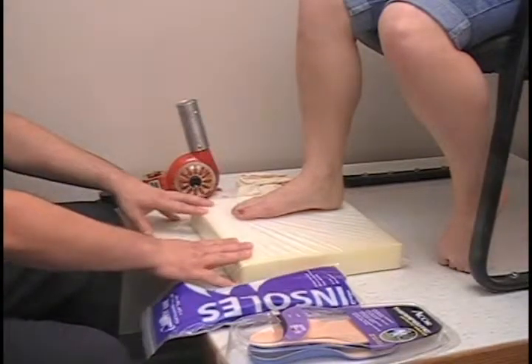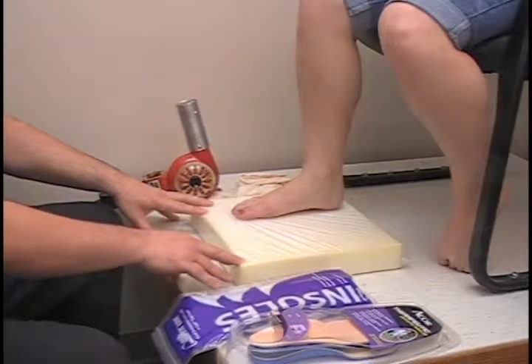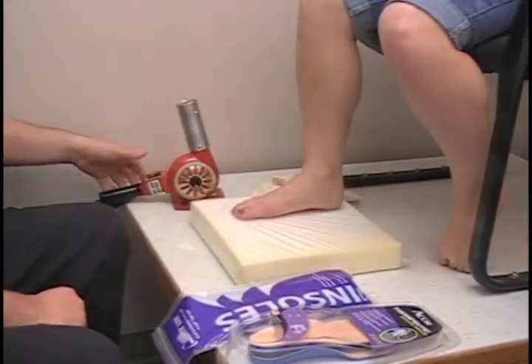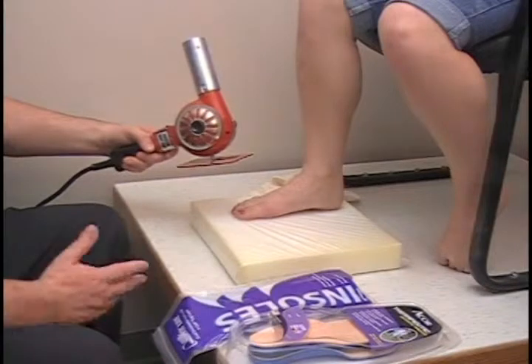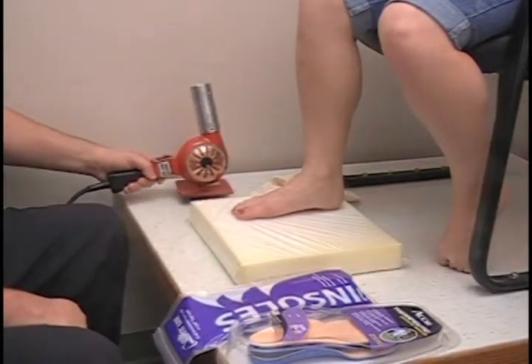You will need a molding mat or pillow of some sort — I like two inch upholstery foam. You will need a sock on the patient, so if they didn't bring any socks in, casting socks work just fine. And then finally a heat gun. This one here is 500 degrees, so a 300 to 500 degree heat gun is what I recommend — no hotter than 600 degrees.